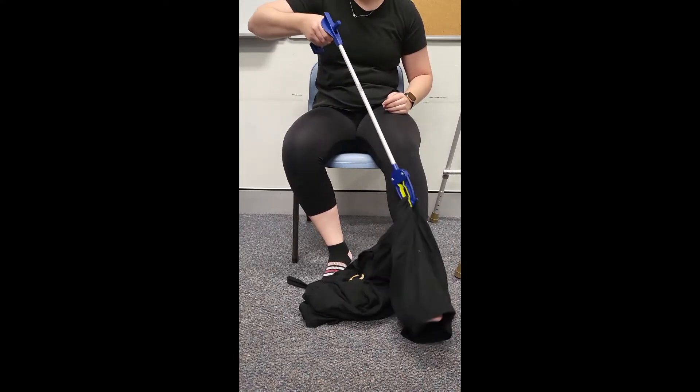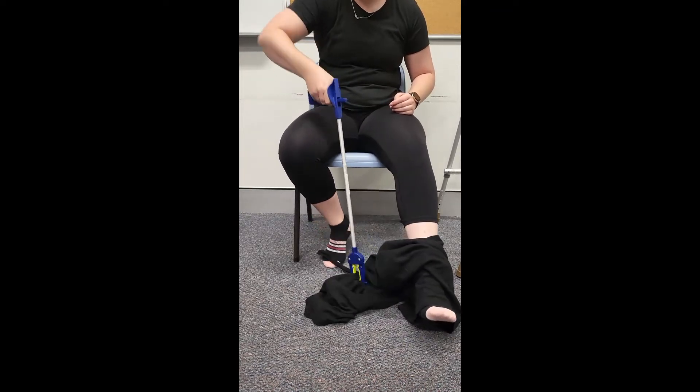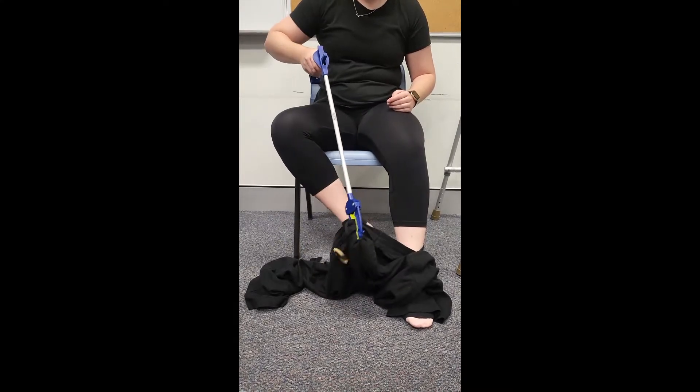First, position the pants on the floor and use the reacher to guide the correct pant leg over the affected side first. Repeat this step for the opposite leg.